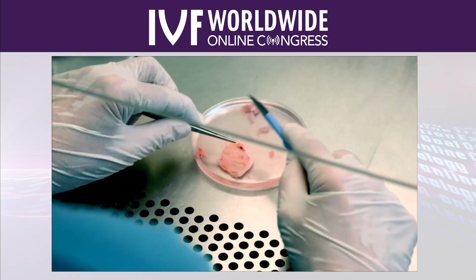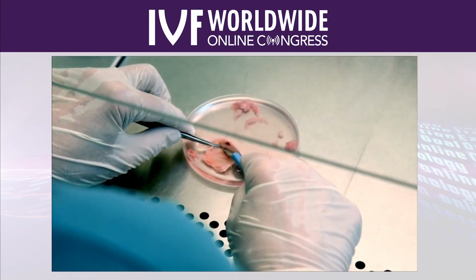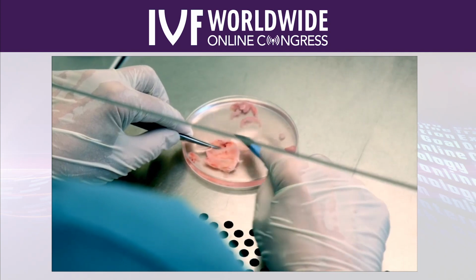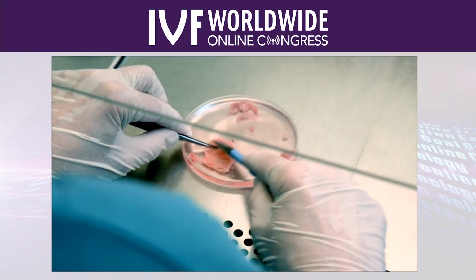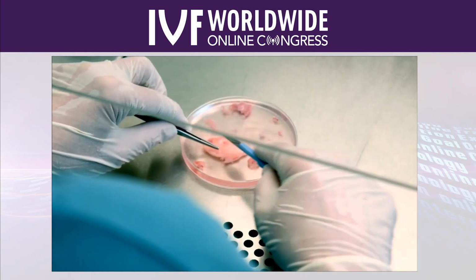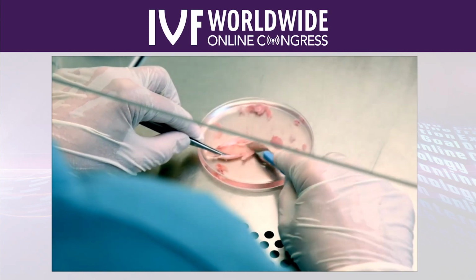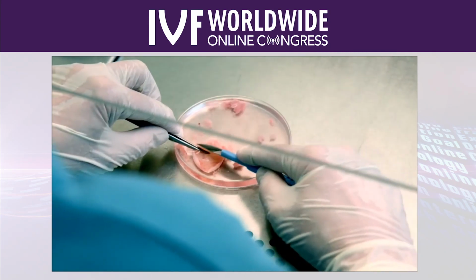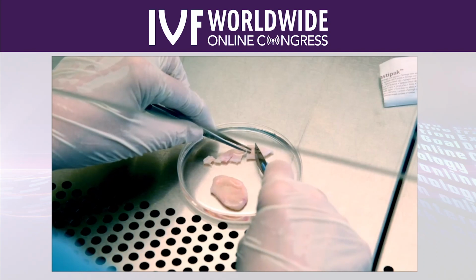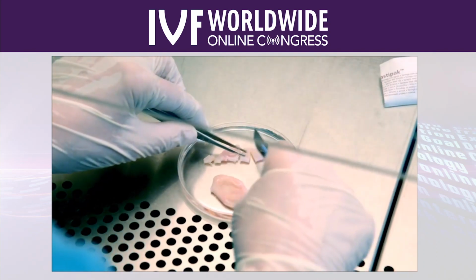And here you can see we have played it forward, so now we are getting to this avascular cortex, where you can see it's all pale and all white, and it's because there's very few blood vessels in the cortex. And this is the reason why we can actually freeze the tissue and prepare the tissue, that the cortex is quite hard and fibrous. And then we can actually isolate it in this way.